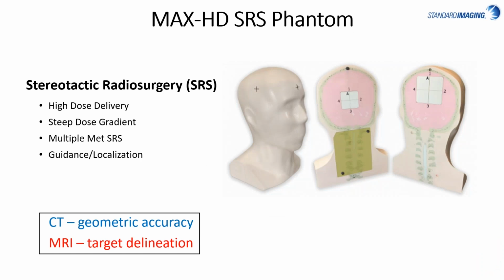Okay, so stereotactic radiosurgery, or SRS, per AAPM report 54, can be done basically in two steps. First is to define the shape and location of the lesion in the stereotactic frame with CT or MRI. And the second is to develop and deliver planned treatment with concentrated dose in the target and steep dose gradient external to the treatment volume. Of course, the rapid dose fall-offs is important to spare the normal brain tissues.